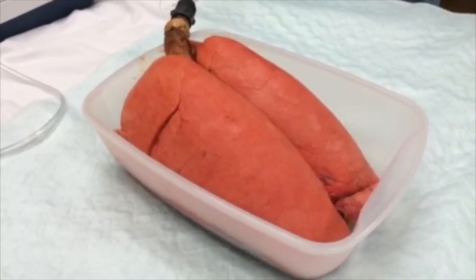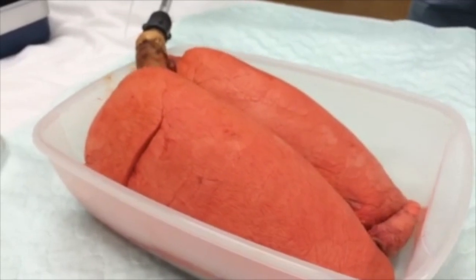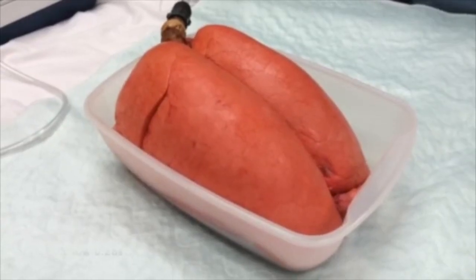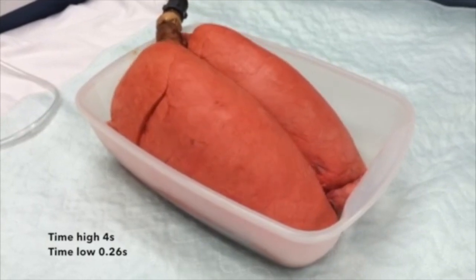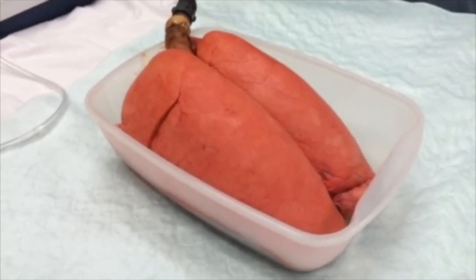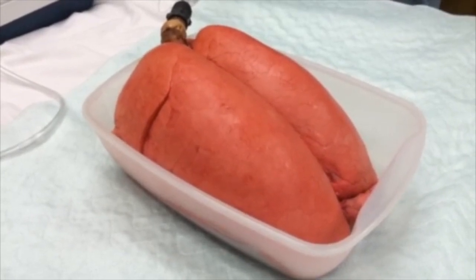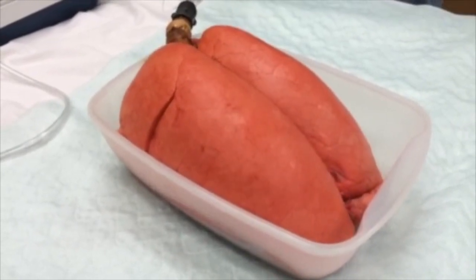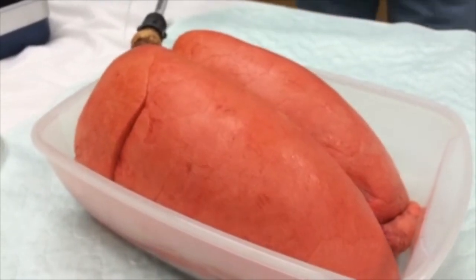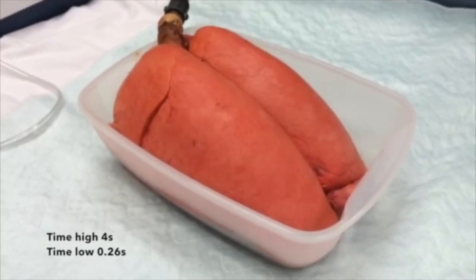However, there is a workaround for transport ventilators that do not have APRV settings. We can sort of mimic the APRV settings that the hospital has. So hopefully we'll be able to transport that patient successfully on a transport ventilator that does not have APRV settings. I do want to caution anyone attempting this strategy that you're going to want to spend extra time at bedside with the patient on the transport ventilator to ensure that the patient tolerates the makeshift APRV settings.